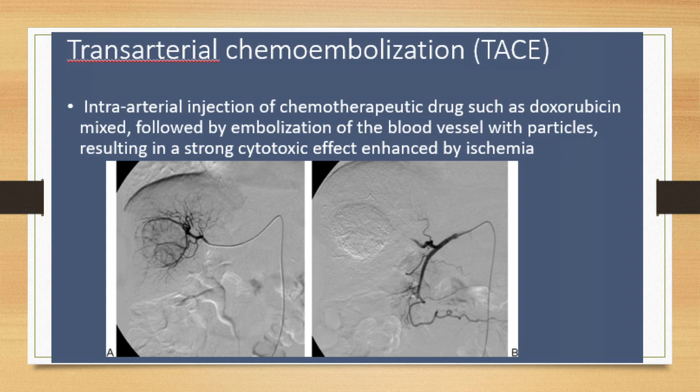We talked about why we give contrast for tumors and CT and other imaging. They have all these abnormal vessels. So this is a normal vessel, nice and smooth. These ones look like spider webs. That's what tumors do. They develop these weird vessels. So the radiologist puts this in, injects it, and they can see that all these abnormal vessels are right in this area. That's where the tumor is.